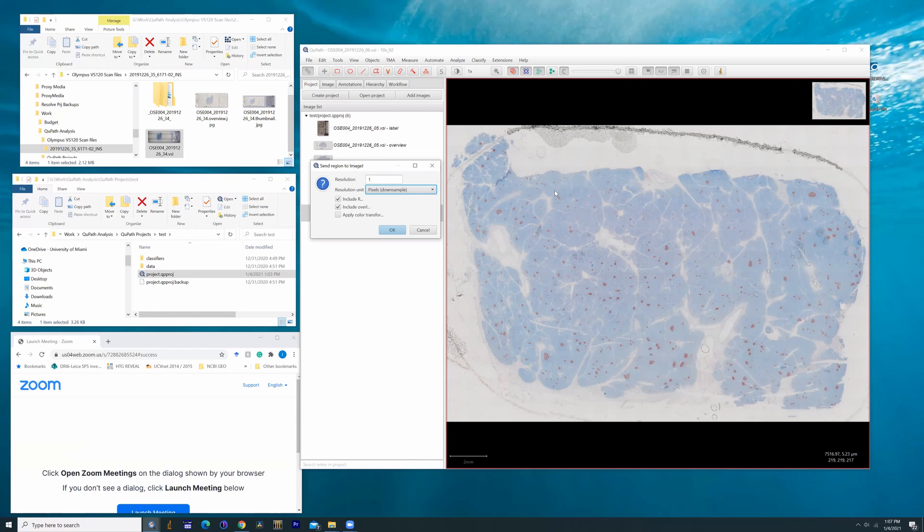Because as it stands, ImageJ can't really resolve images greater than two gigabytes in size, except through bioformats, basically up to two gigabytes. After that, the file just collapses. So this will down-sample it for us.